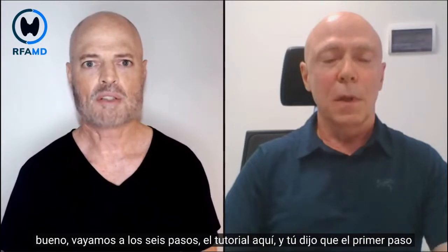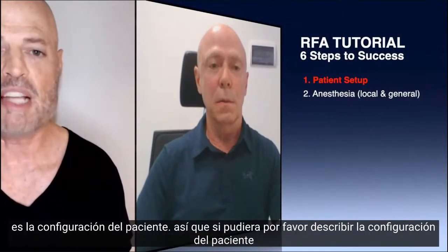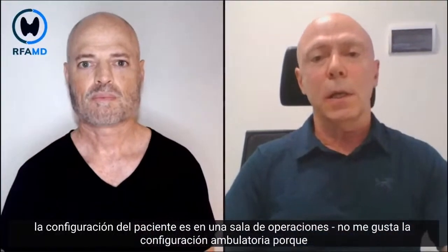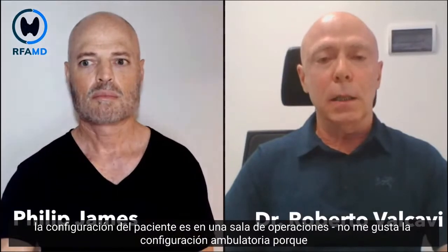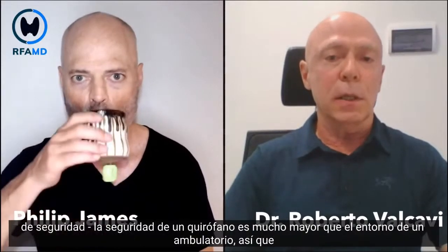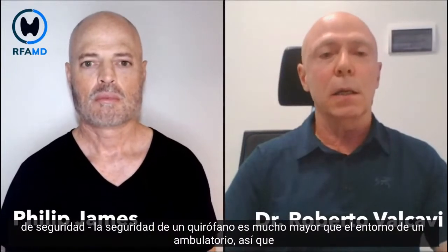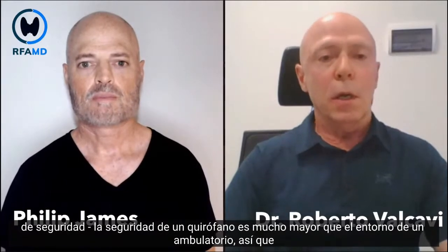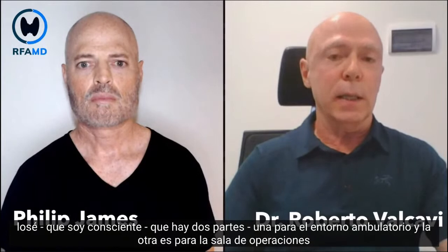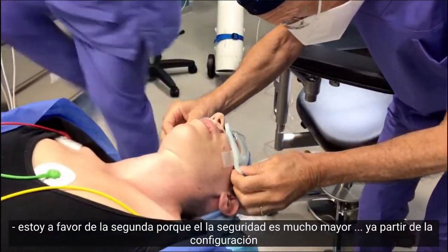Well, let's jump into the 6 steps, the tutorial here. You said the first step is the setup of the patient. If you could please describe the setup of the patient. The setup of the patient is in an operatory room. I don't like the ambulatory setting because of safety. The safety of an operatory room is by far greater than that of an ambulatory room. I'm aware that there are 2 parties, one for the ambulatory setting and one for the operatory room. I'm for the second one because the safety is much greater.